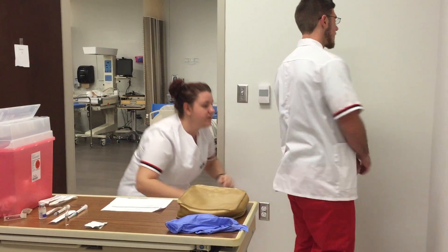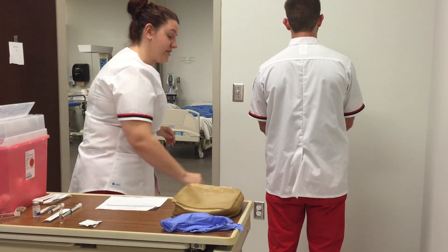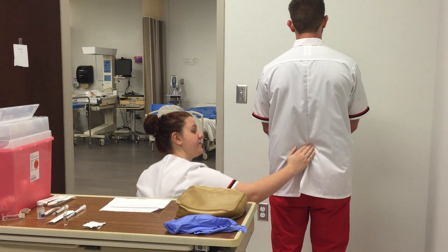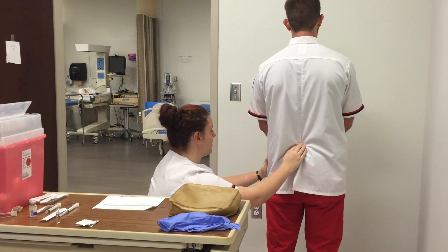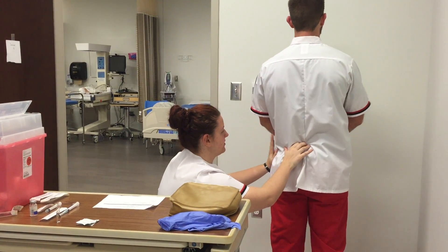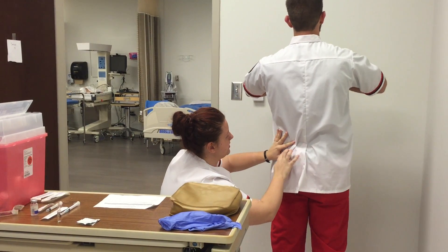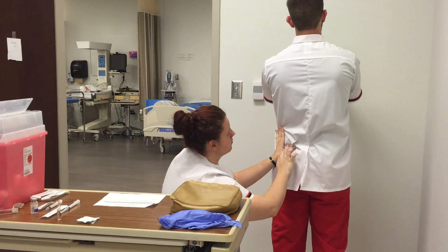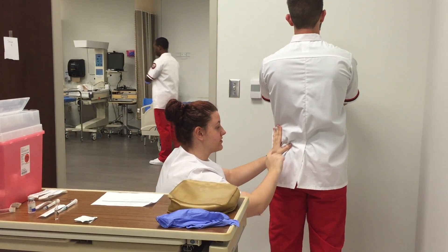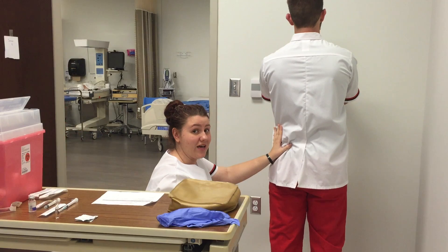Can you turn your back for me? Thank you. This is going to be for the dorsal gluteal injection site. I'm going to find the landmarks — can you bend your leg out for me? Thank you. Locating the greater trochanter, I come up and over to inject right here in the dorsal gluteal.